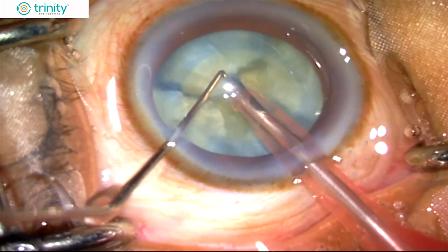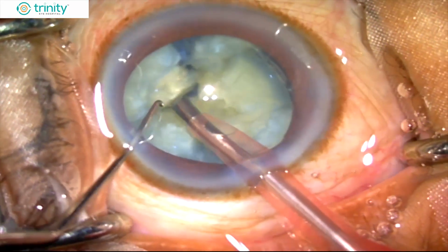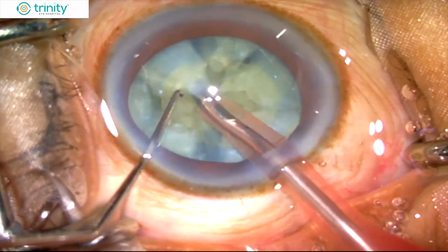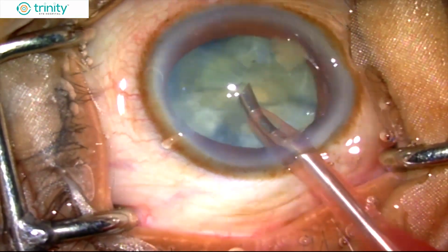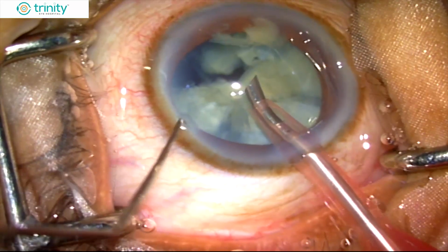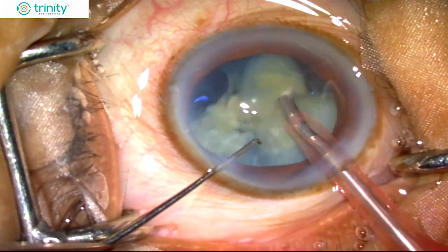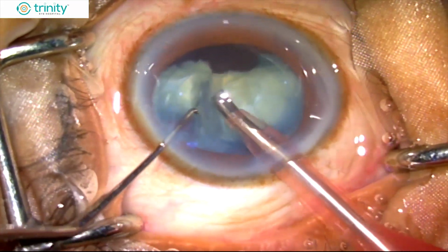It's not a very hard cataract, so it's easily breakable. Now once an adequate number of pieces have been made, you can start eating up the nucleus pieces. You can see that the anterior chamber is so stable throughout the procedure. There is not even once a surge that is felt, and actually the pieces are coming towards the phaco tip, and the followability is so good. I'm using very minimal power because it's a soft cataract.